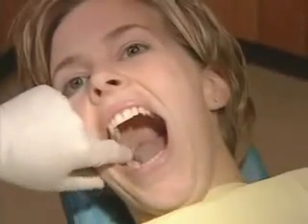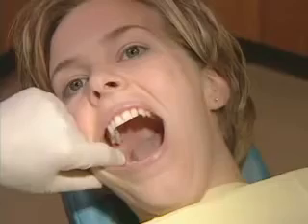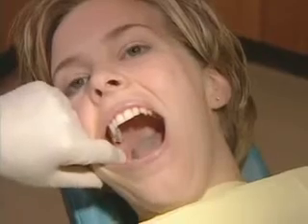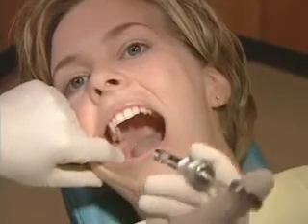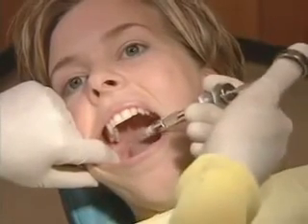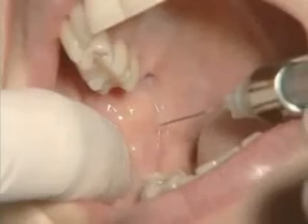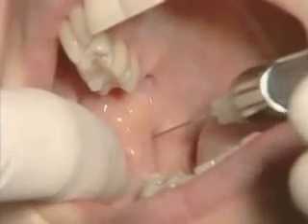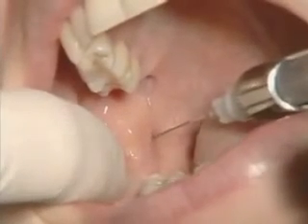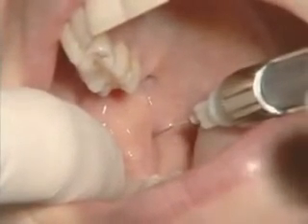After palpating the landmarks, you will insert the needle into the pterygo-temporal depression. The needle is brought in from the contralateral side, with the insertion point directly there, and advanced slowly until you reach 25 millimeters.